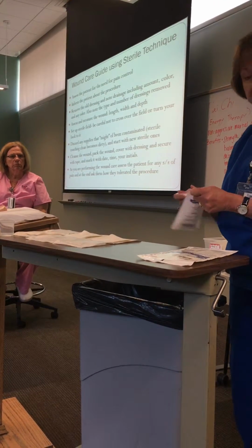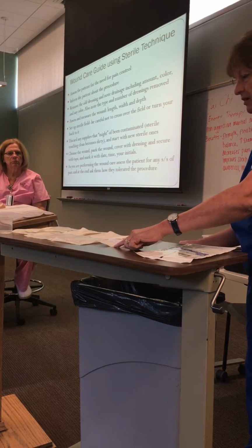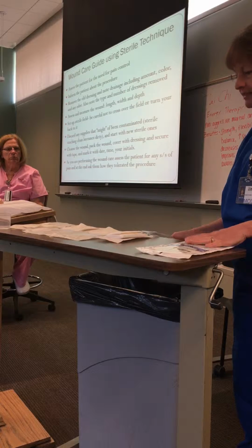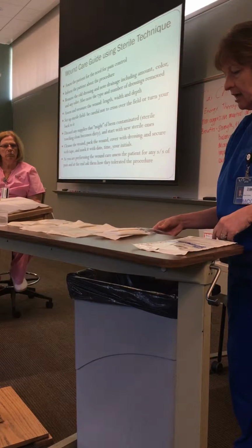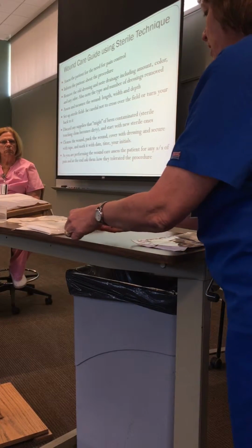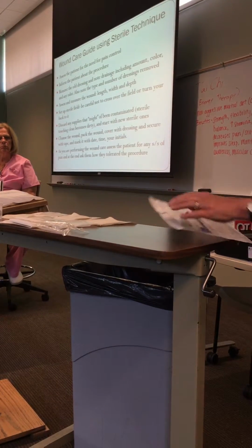This is the easiest for you guys to do that. And then I've got my final one that I'm going to place on there. I think the tray tables in the lab are a little bit smaller than this one. This is an older style one. Right now, what you guys can do is move this gauze up here if you need to, in order to give you more space to open your sterile gloves.